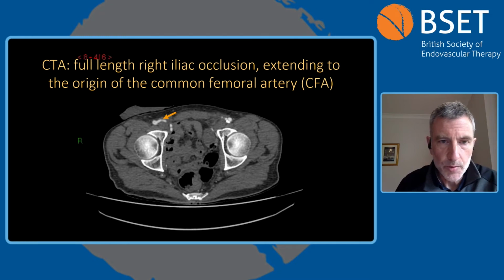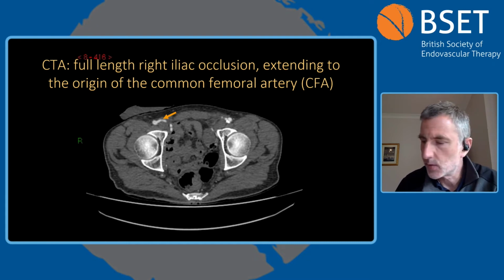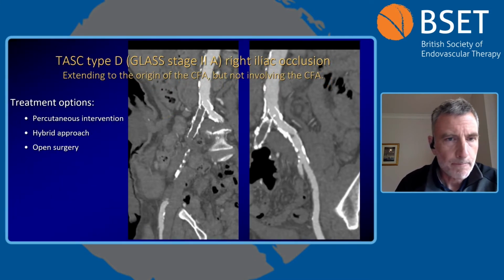It reconstitutes just at its origin, just distal to the inguinal ligament, at the level of some enlarged collaterals, including this, which I think is the superficial external pudendal.